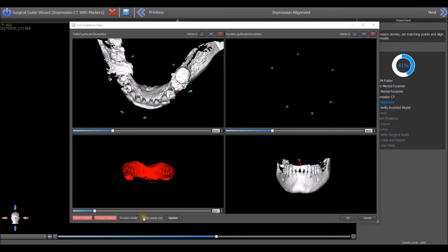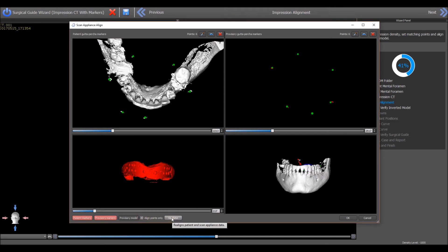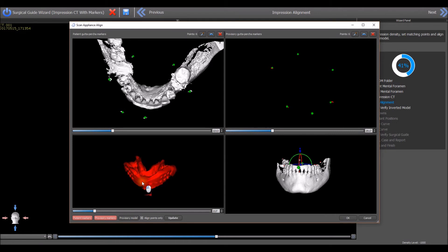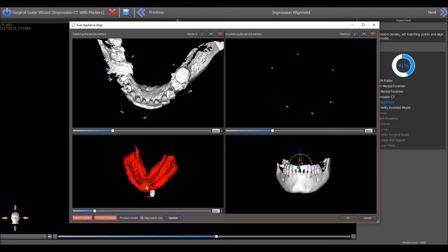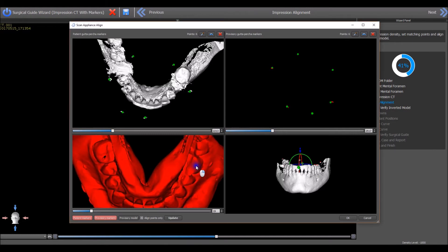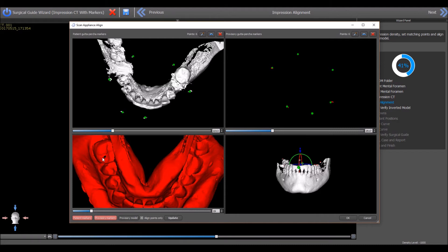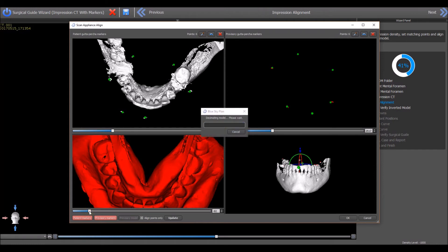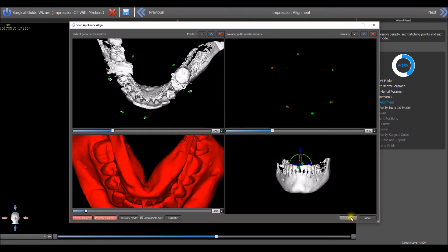Left-click the Align Points Only box and then left-click the Update button to align the two sets of markers in the bottom right view. Finally, hold down the left mouse button and move the mouse to rotate the Impression Scan in the bottom left view to see if there are any holes in the impression. Hold down the right mouse button and move the mouse forward to zoom in. If there are holes, this is an indication that the Impression Scan tray was not prepared properly according to the steps outlined in the beginning of this video. If there are tiny holes, lower the slider underneath the scan in very small increments until the holes have been filled. Then press the OK button.